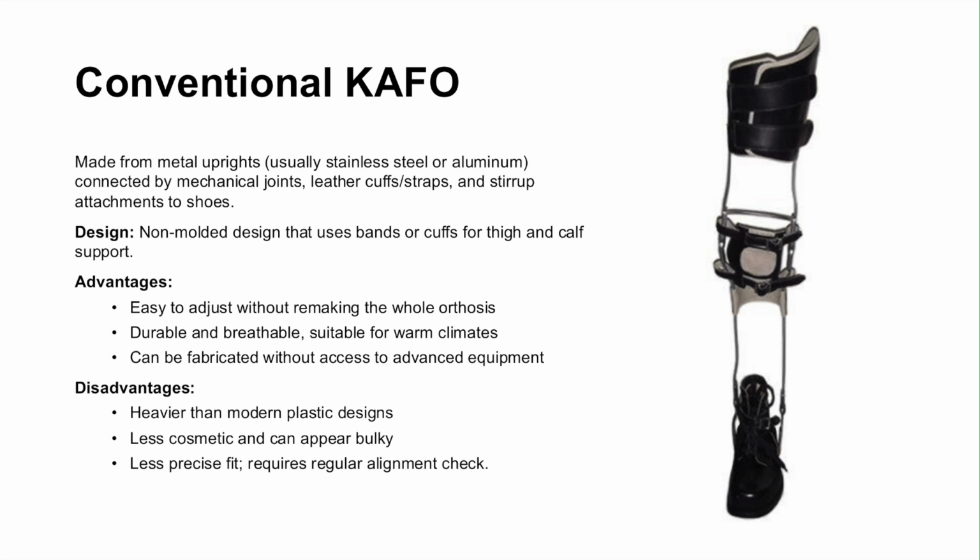You can Google what a drop lock and bail lock are. I will share with you one video that shows the difference between drop lock and bail lock at the knee. While they may lack the sleek appearance of newer designs, they are invaluable for individuals with fluctuating edema or those who need breathable interfaces.